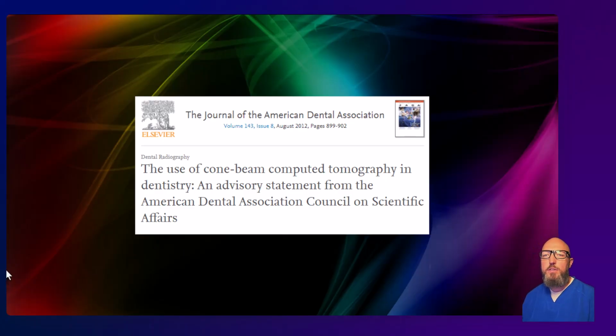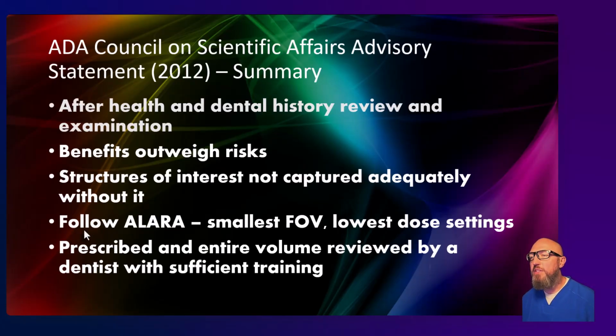So the American Dental Association issued an advisory statement in 2012 on appropriate use of CBCT. The AAOMR, the Academy of Oral and Maxillofacial Radiology, has positioned statements on implants and endodontics. The European SEDENTEXCT guidelines are also widely cited, and all of those emphasize the same principle. Here I've kind of summed up what they say.